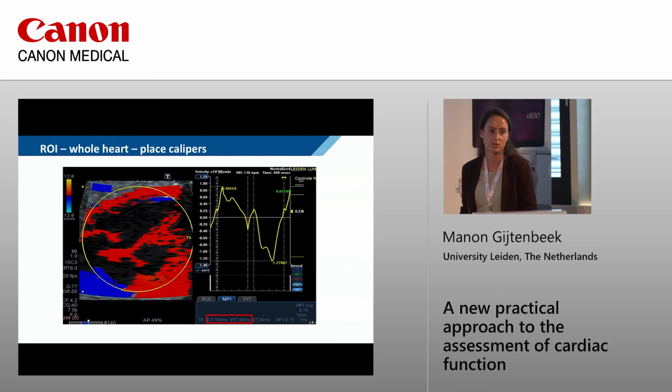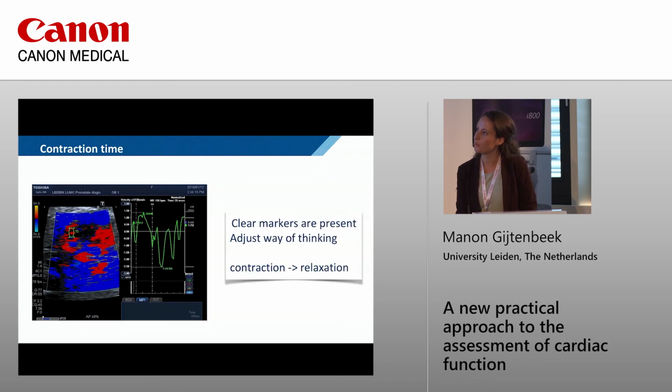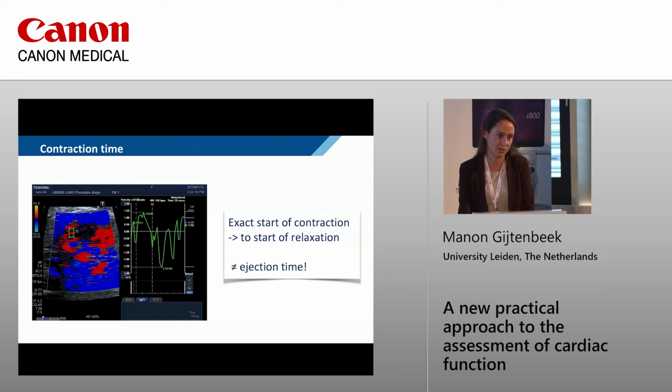just a phase of the heart pumping. So it's just a different way of thinking. These clear markers are just indicating the contraction and relaxation phases of the heart. And it's not the same as ejection time if we look at the contraction time.